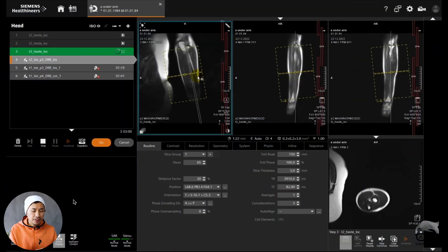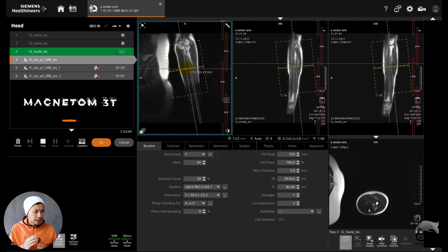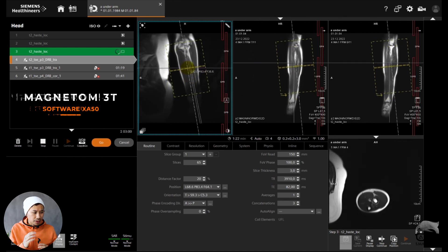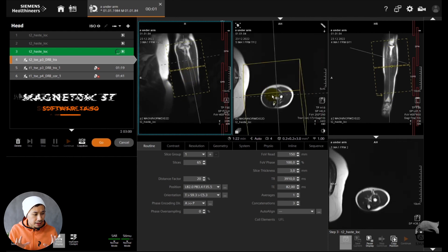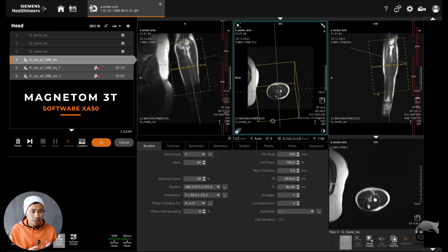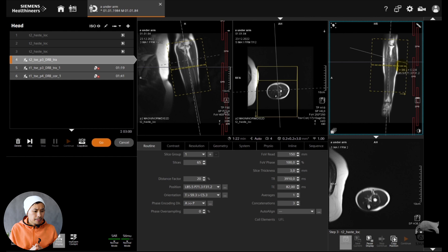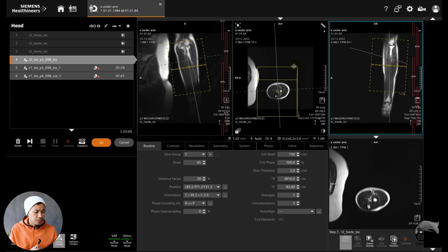Let me show you how I did the imaging of this underarm, the different sequences, and the different patient positions. We are on a 3T scanner, and as you can see here I'm doing three different sequences.